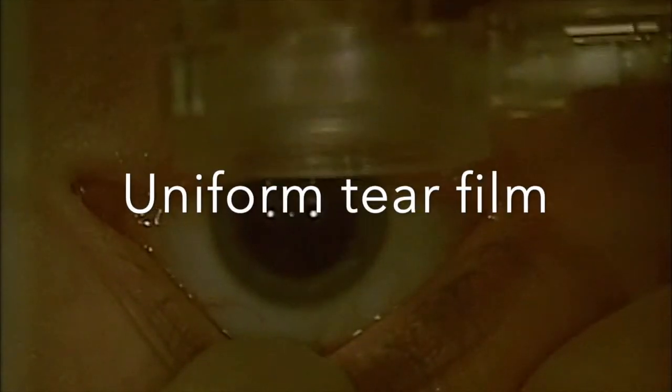Also, it's important to avoid contact with the cornea as you nudge the lower lid out of the way with the interface here. That can disturb the mucous layer, leading to localized dehydration, and localized dehydration during applanation can lead to an uneven flap thickness.